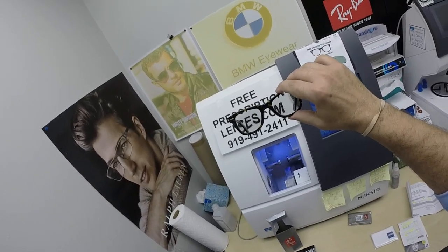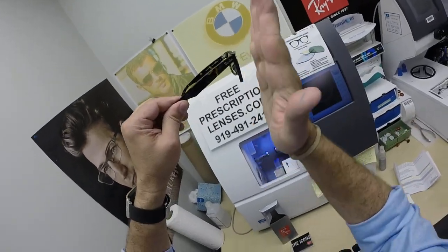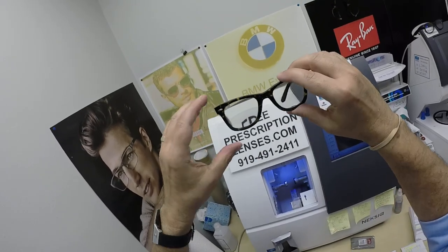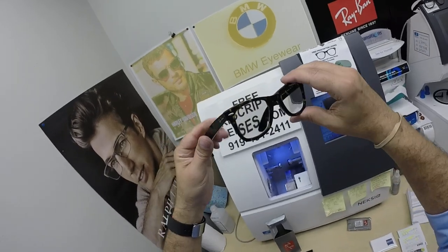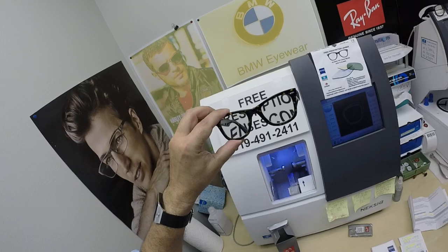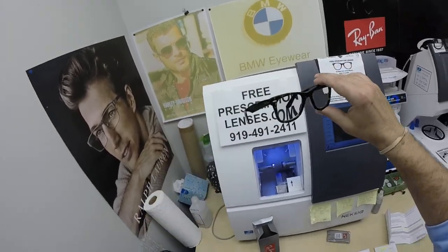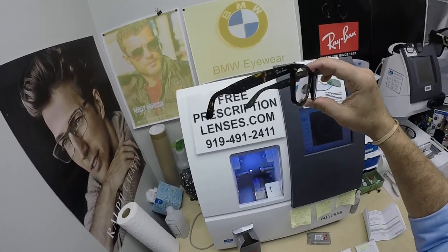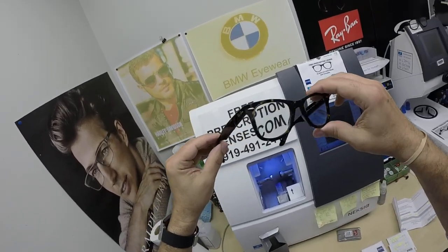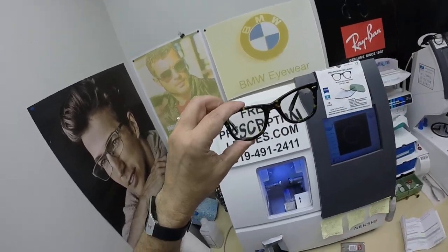I started doing this about 2012. Ray-Ban came out with the 5121, and now they have the 4340. The 4340 has the original pantoscopic tilt — most frames are more perpendicular, about 90 degrees, but this has the pantoscopic tilt. When it goes the other way, it's called retroscopic. This frame started it all — it was introduced in 1952, and in 1992 they came out with the original Wayfarer that I fell in love with. The classic shiny black is 901; this is the 902 Tortoise, a dark tortoise. No two tortoise frames will ever be the same — you can see the light marks here in the frame.